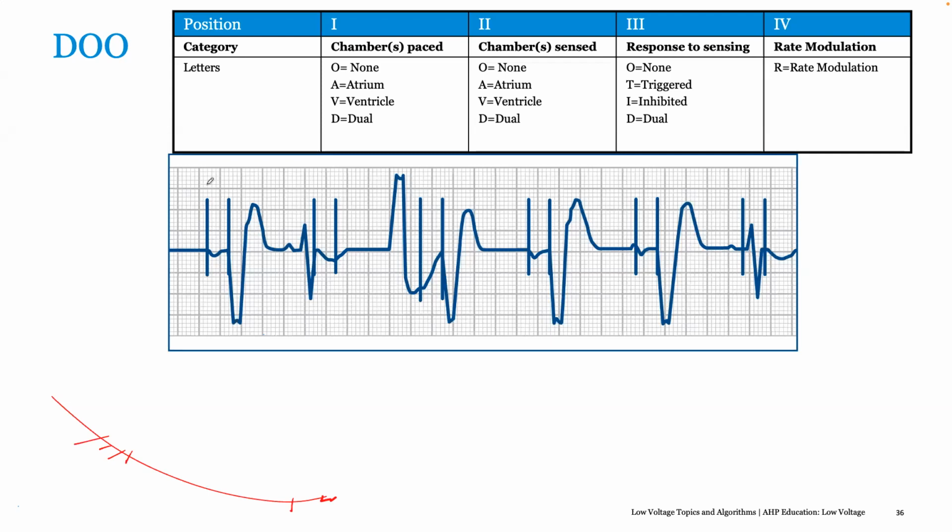After that, we sent him back to the referring cardiologist, who saw the patient on a follow-up and I asked him to do an EKG. The EKG was forwarded to me 2 days ago. Can you look at it and comment on what type of programming we should do for this patient?